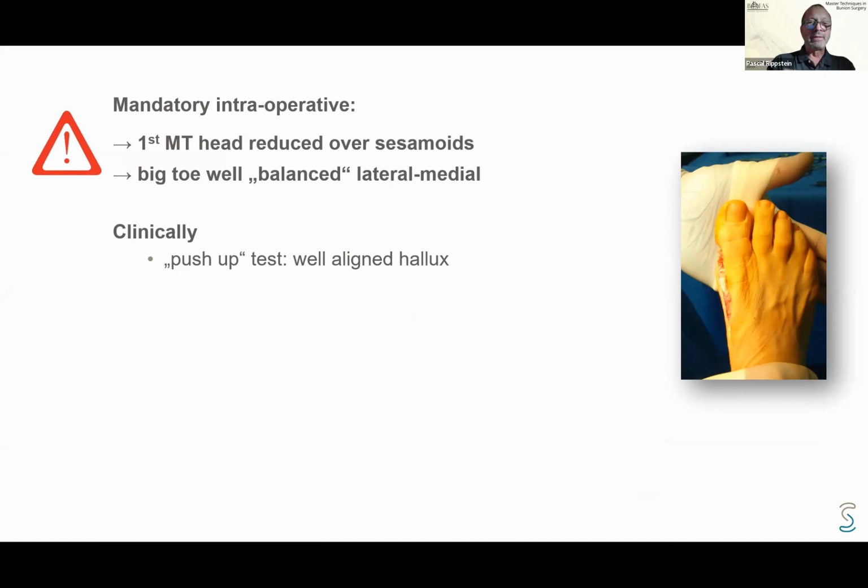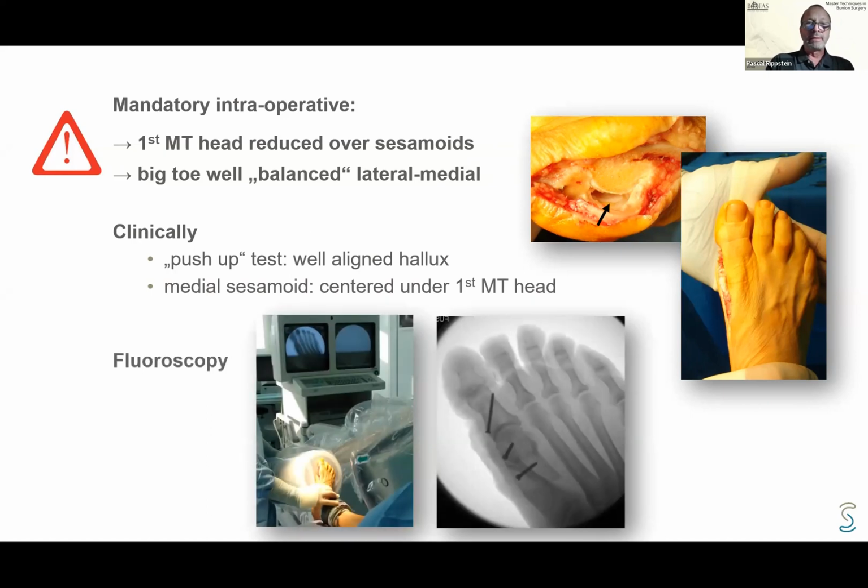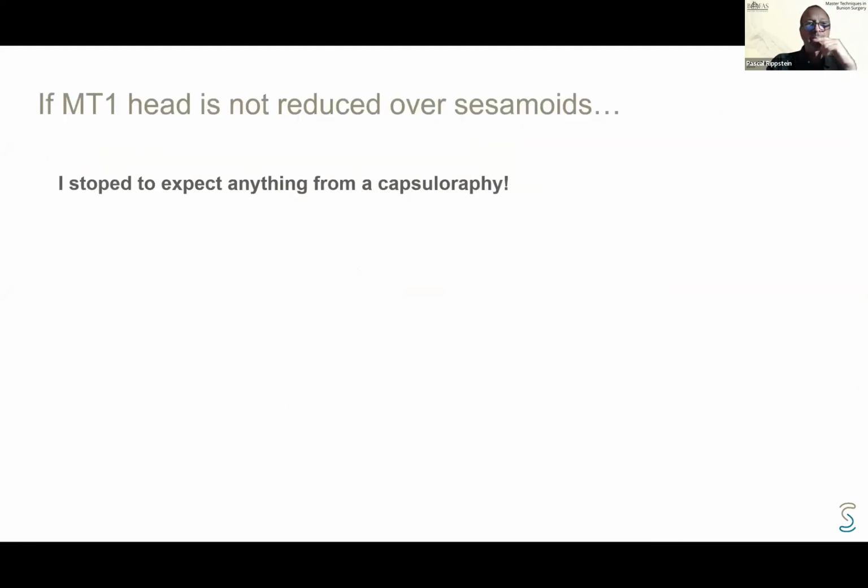You see here, the capsule is still open. We didn't do anything, just this opening door and pushing the head over the sesamoid. We want to check that your head is really over the sesamoid, and you can see here, the medial sesamoid is centered on the metatarsal head. And if you check this with fluoroscopy, again, the capsule is not closed here. You see that having performed this door on the lateral aspect of the MP1 joint and having moved the distal fragment laterally, we got a nice alignment. And this situation will provide a long-lasting good result of the correction.